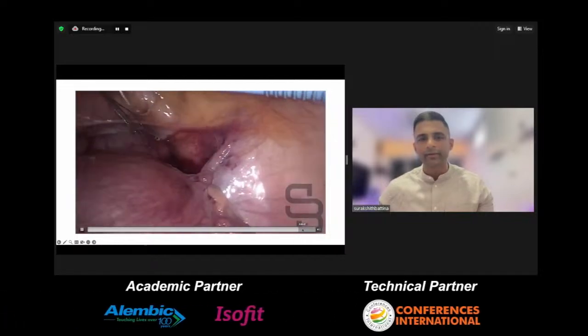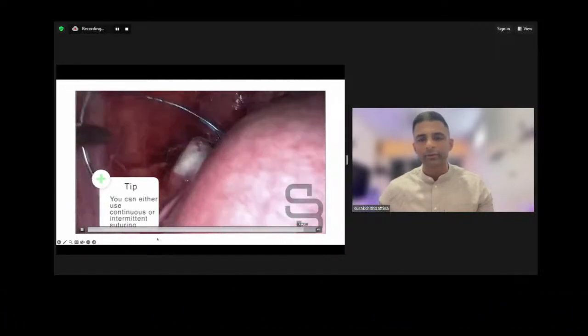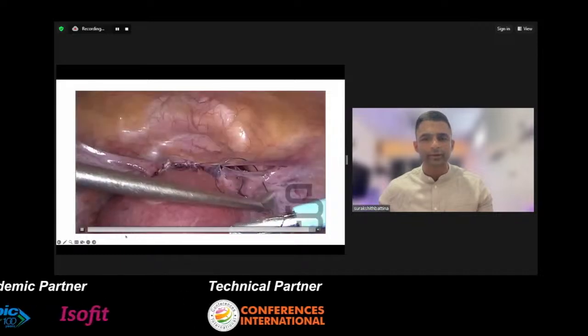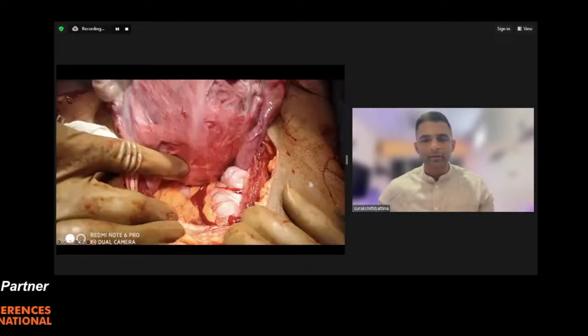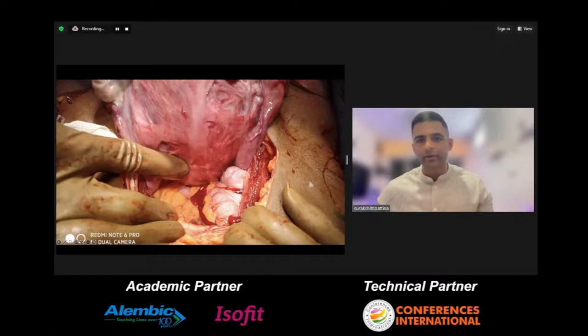And finally, to close the UV fold, either you can go for a continuous suturing or you can do a single suture. We've done both. I'll be showing you that pretty soon. So this is how this stitch looks while you're doing the C-section.